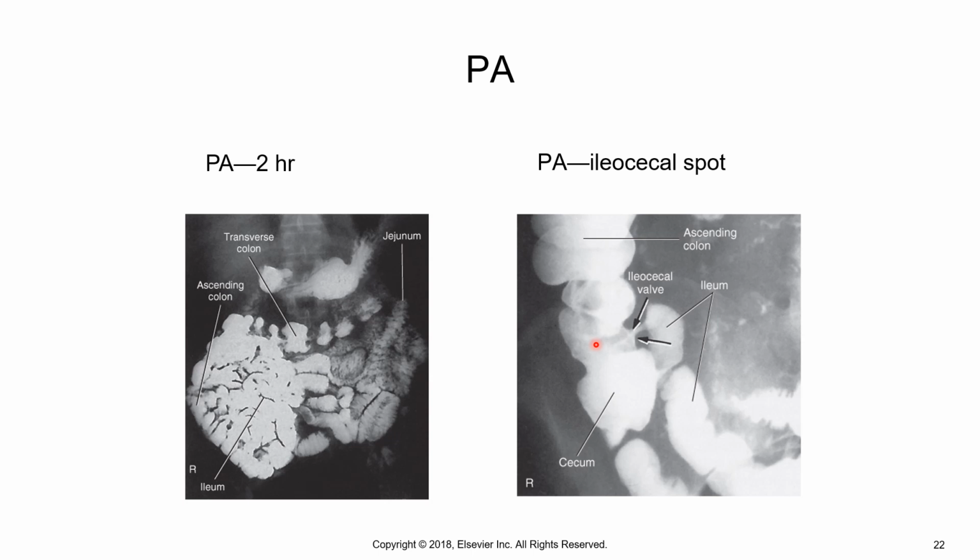I think it's the back of this chapter. The way they've got this is so screwy. Figure 13.6 on page 526 is this. So you've got the ileum passing through the ileocecal valve into the cecum. So this proves that the entire small intestine was visualized, and that would deem the study complete.